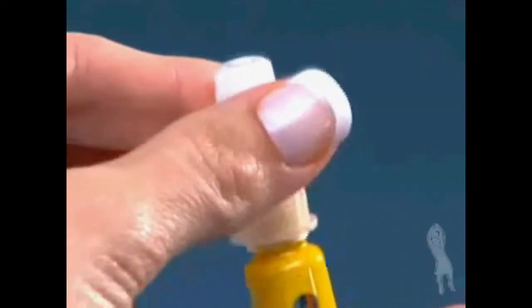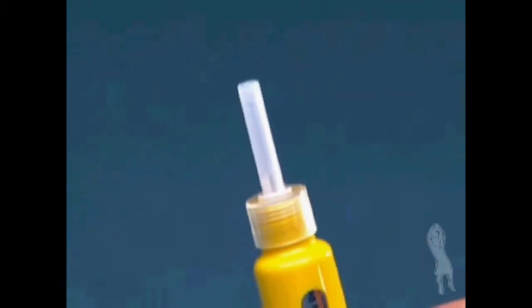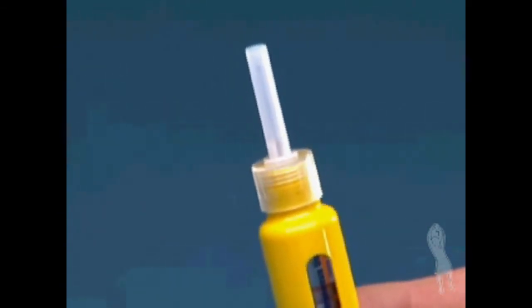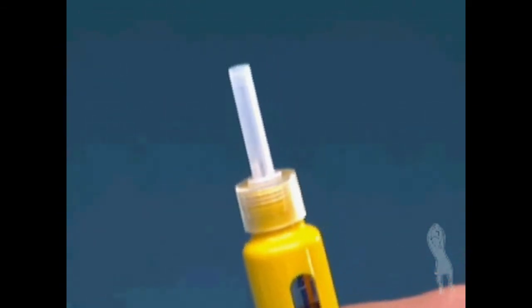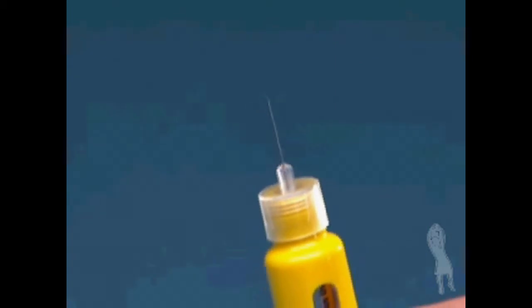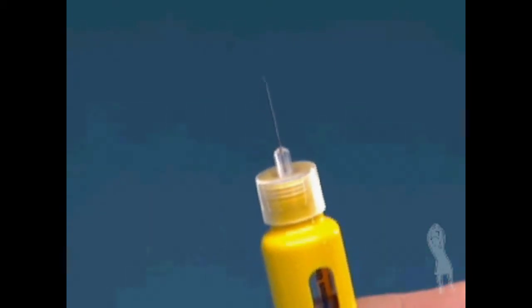Pull the outer needle shield off gently, leaving the inner needle shield in place. Do not throw the outer needle shield away. You will need it to dispose of the needle after injecting the medication. Carefully remove the inner needle shield and discard it. Do not touch the needle or let it touch any surface while uncapped.